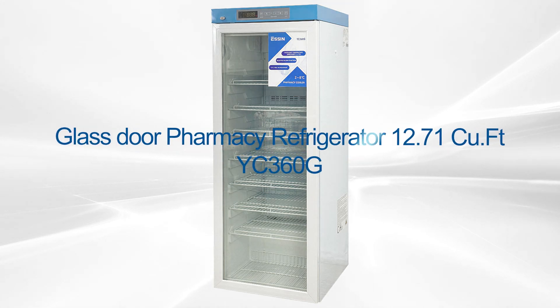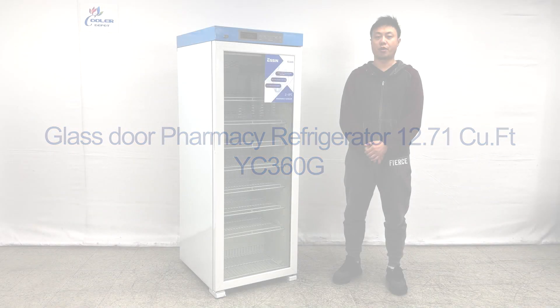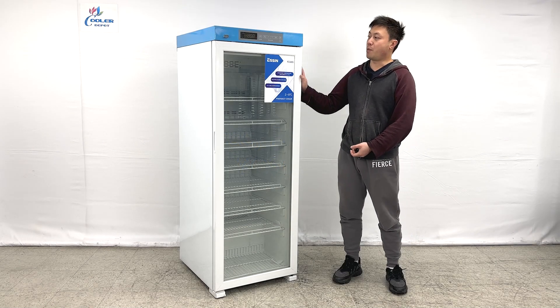Hello everyone, welcome to our new video today. I'm going to go ahead and introduce our newest product on my right hand. This is the pharmacy refrigerator.